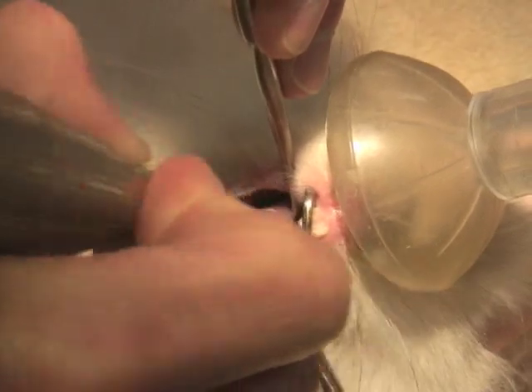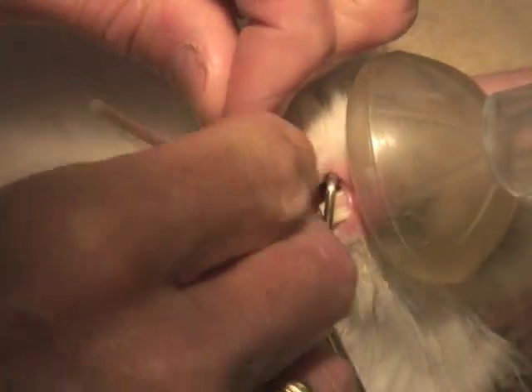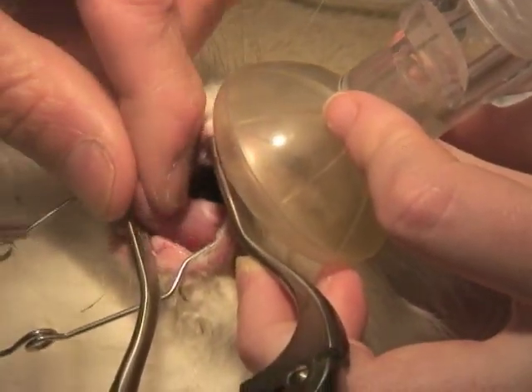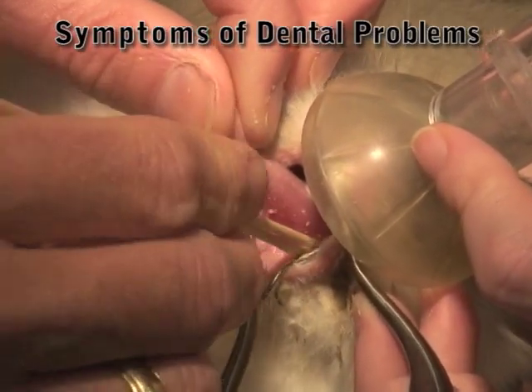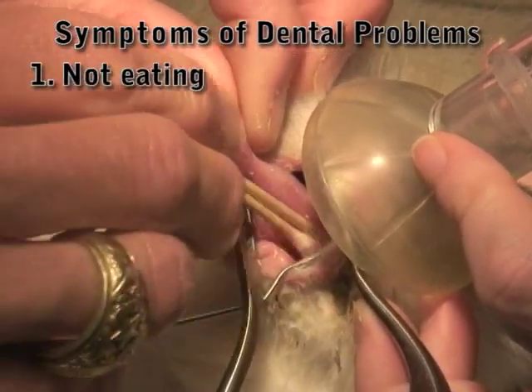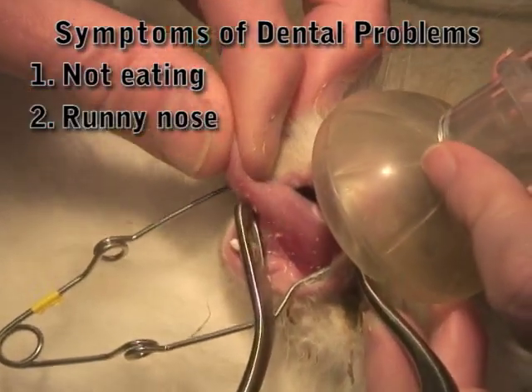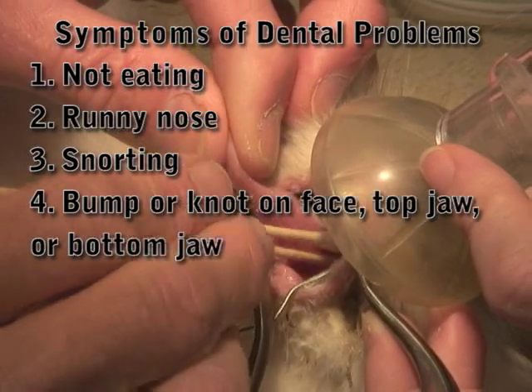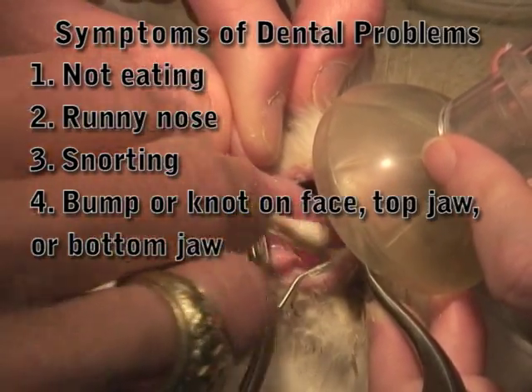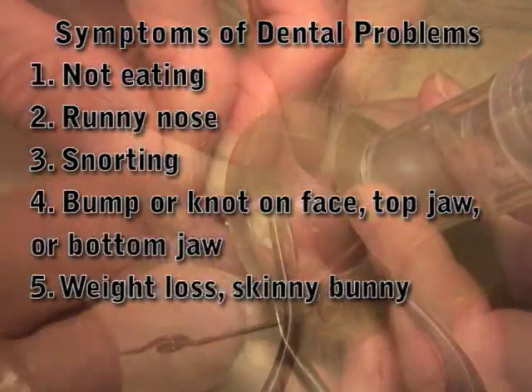You try not to hold the cutting wheel on here too long — you don't want to make the tooth hot. This is just a little file to help smooth it up. Signs of dental disease in rabbits include not eating their veggies, a runny nose, snorting, and sometimes a little bump or knot that develops along their face on either the top jaw or the bottom jaw. Those signs also include weight loss, being a skinny bunny, and drooling is also one.